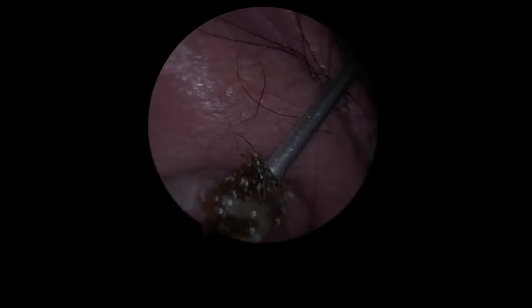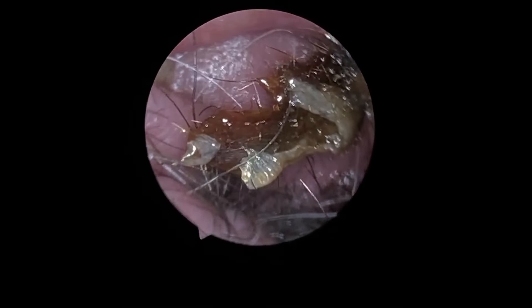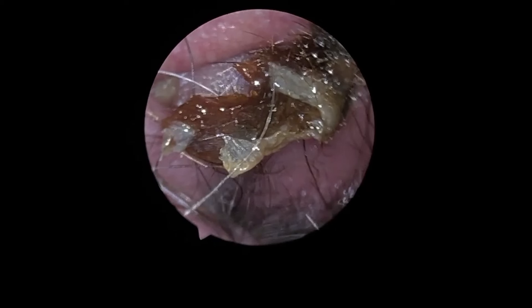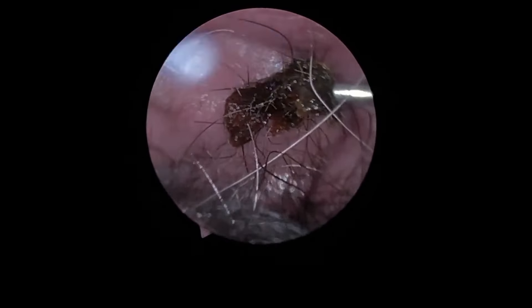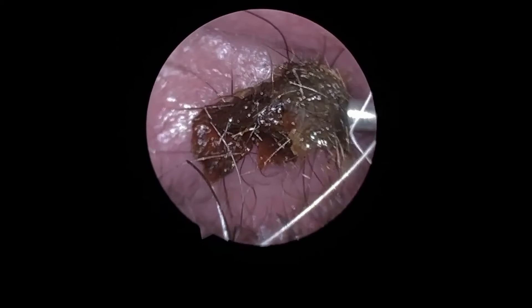This is quite a hairy piece of blockage removed, not surprising because of the large amount of hairs in the entrance of the ear canal which have become stuck in the wax over time. The wax is encapsulated in light coloured keratin around the edges, with the more coarse, rougher tragus hairs — which sprout out in the tragus part of the ear in some people — mixed alongside the darker wax.